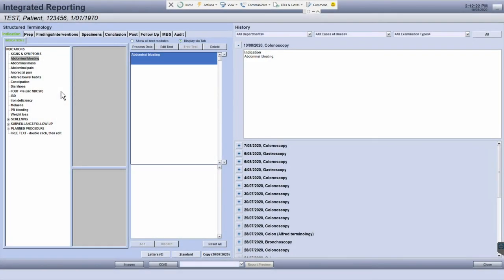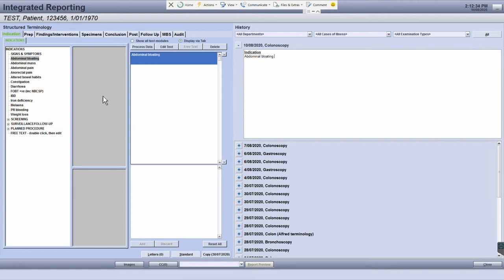Standard report templates can be used to pre-fill your report with text. This feature is particularly useful for routine procedures which may not have many significant findings, so you can pre-populate most of the information for your report.